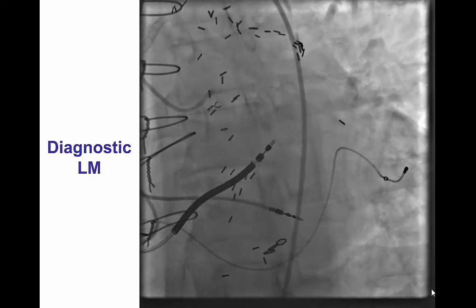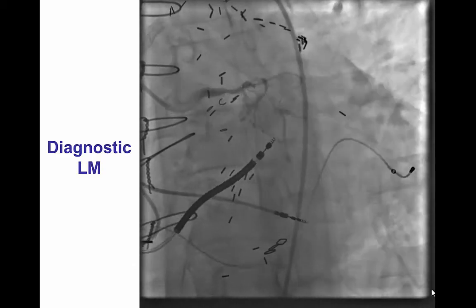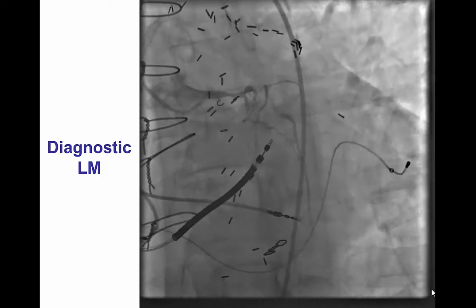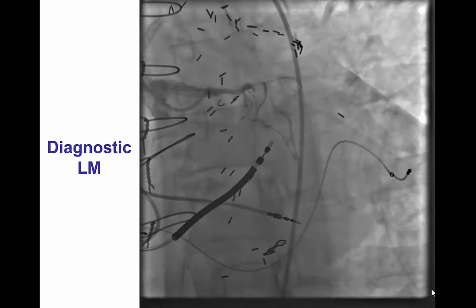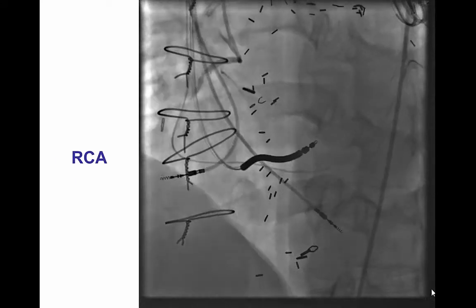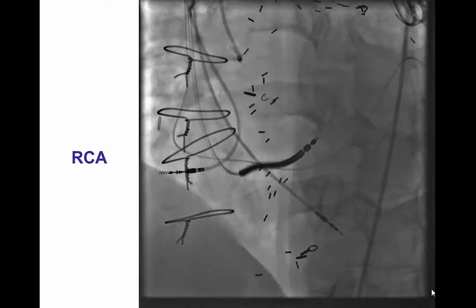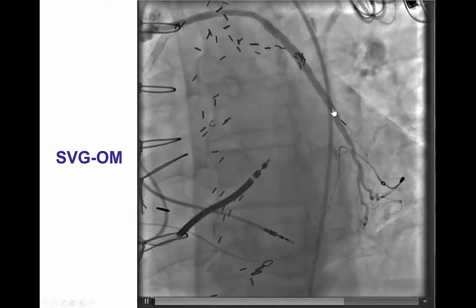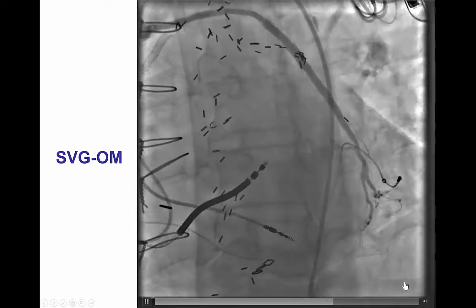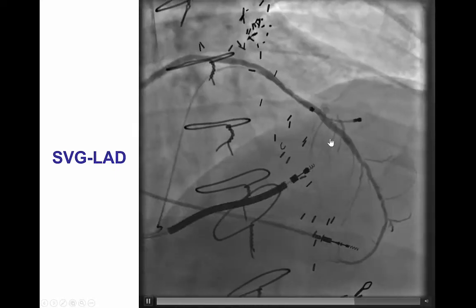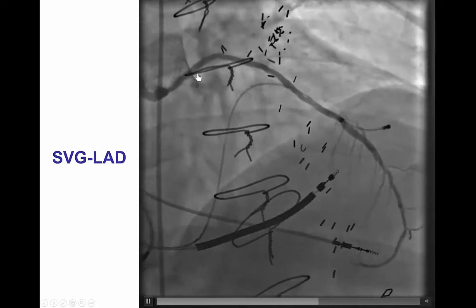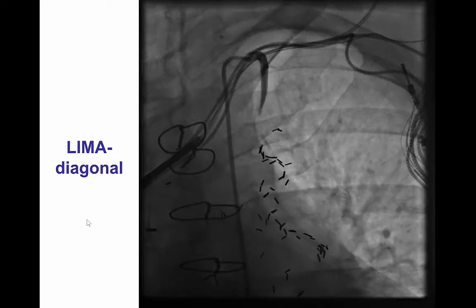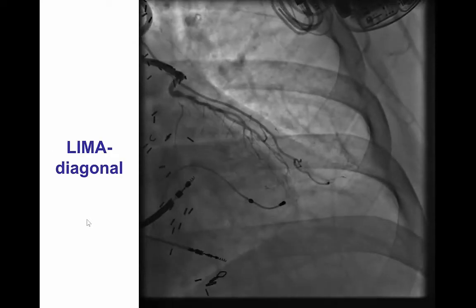This patient presented with recurrent angina after multiple stenting attempts of a saphenous vein graft to the left anterior descending artery. Diagnostic angiography showed patent left main with ostial occlusions of the LAD as well as the circumflex, a CTO of the distal right coronary artery with ipsilateral collaterals filling the PDA and PLV, a saphenous vein graft to the obtuse marginal that was patent with good flow. The vein graft to the LAD had undergone multiple stenting procedures and had currently stenosed in its ostial portion, and the patient also had a patent LIMA to diagonal that appeared normal.